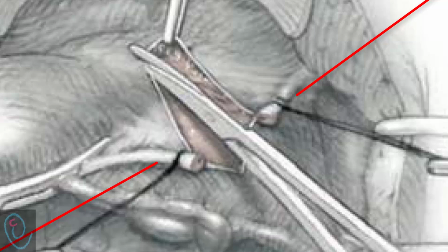Scissor tips are directed upwards to be seen through the peritoneum as they advance. Gentle opening and closing of the scissor blades during advancement separates the peritoneum from the underlying connective tissue and uterine vessels. Now the elevated anterior leaf is incised either sharply or with the use of an electrosurgery tip. Continue the incision to the level of the vesicouterine fold.